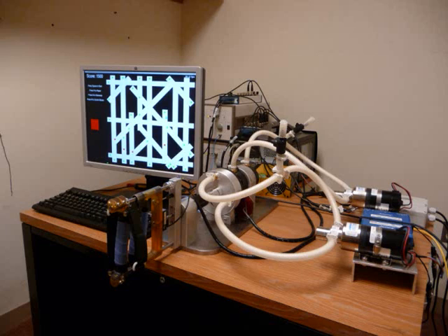It experiences very little friction losses and has very high frequency response. Also, the first generation prototype of the system is MRI compatible, which has great research potential. However, the hydraulic actuation system is quite expensive and leads to a complicated setup.